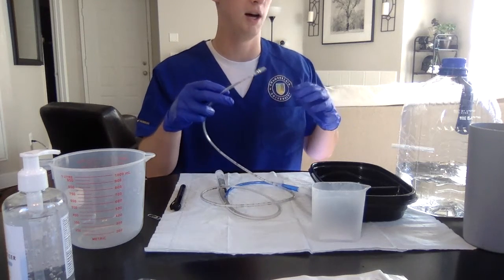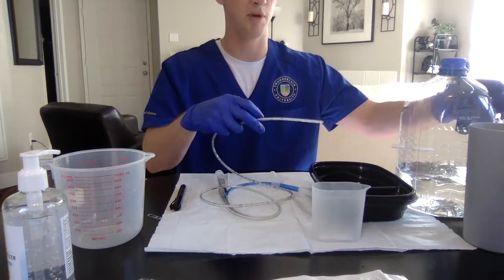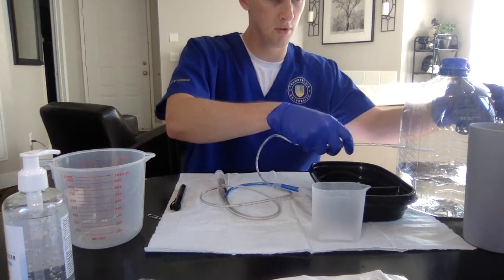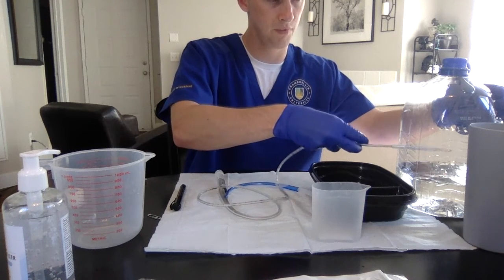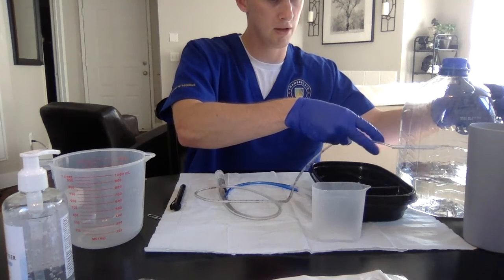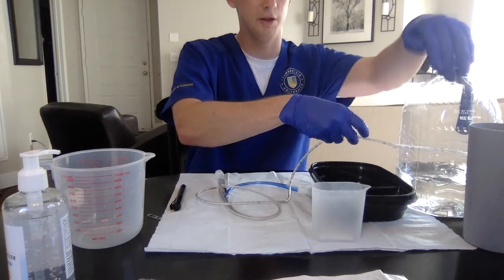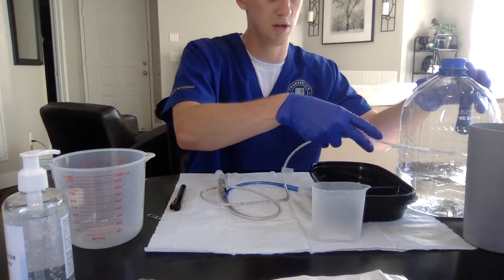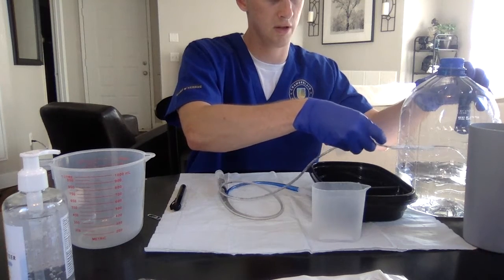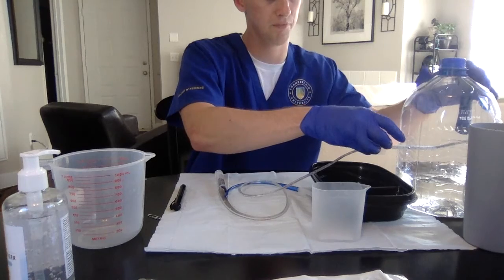So now at this point, I would have my client tilt their head backwards. I'm going to have my hand behind their head. I'm going to begin the insertion. I'm going to keep going. They'll probably be coughing and gagging this whole time. And then right around here, I would have them tilt their chin down to their chest, and they're going to be drinking the water the whole time. So I'd tell them to drink, drink, drink, still going up until we get to my tape marker here.